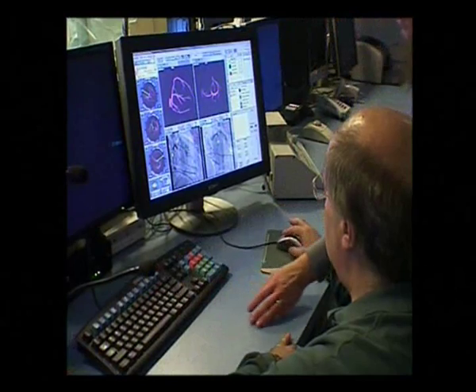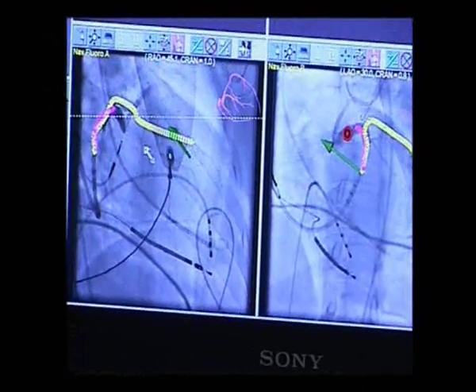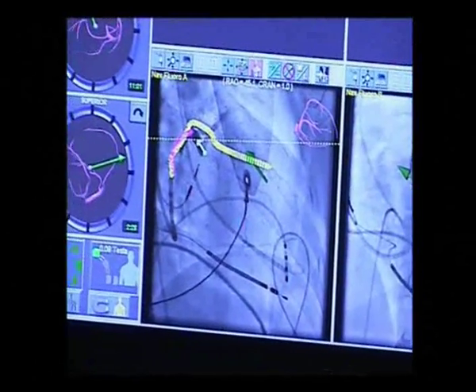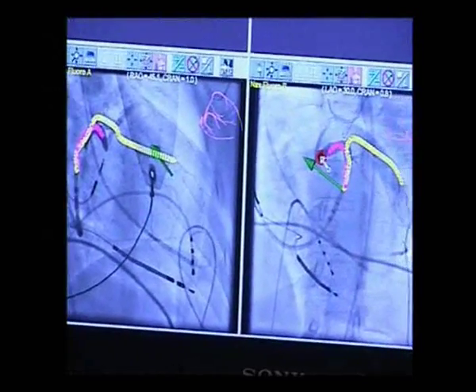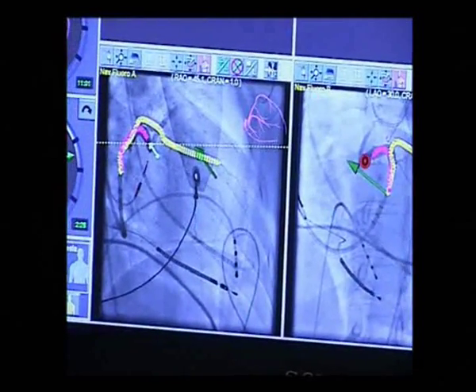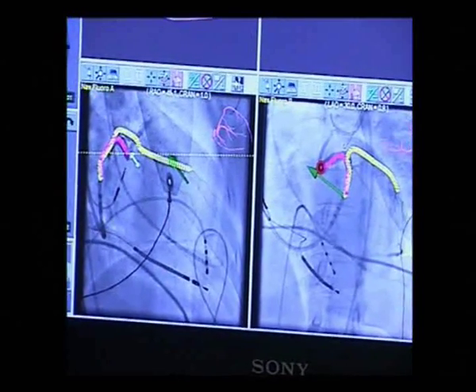Next, we set up the Stereotaxis system before starting magnetic navigation. The desired magnetic field vectors can be set by tracing target vessels on orthogonal fluoroscopic views of two coronary venograms at 90 degrees of separation, shown on the computer workstation. This is done in order to construct a 3D vessel roadmap.